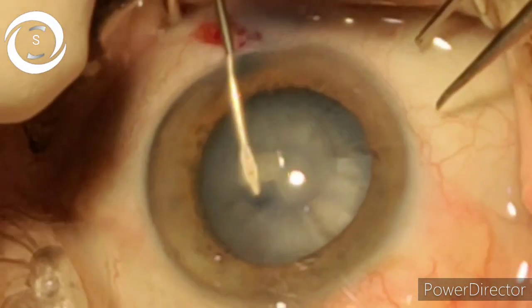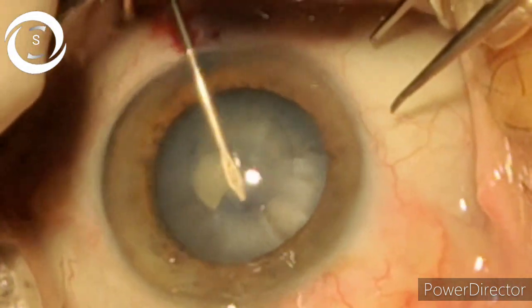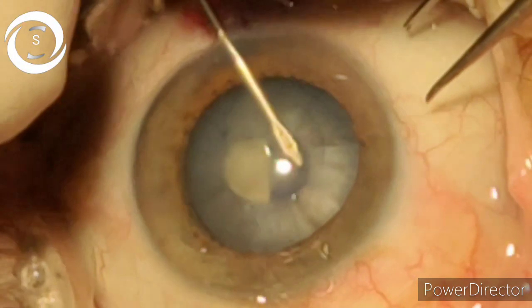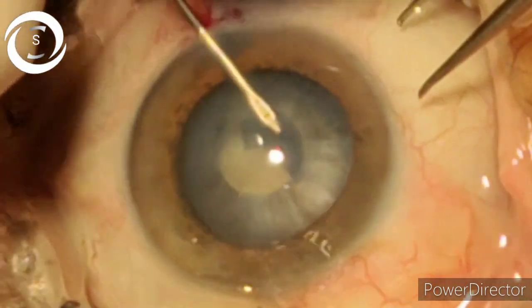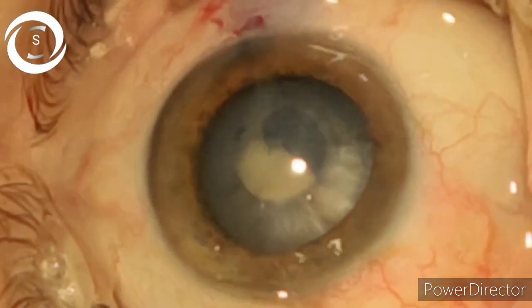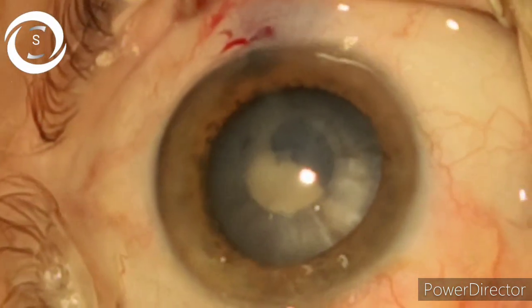First, try to maximally dilate the pupil and put a large amount of viscoelastic to deepen the anterior chamber. Prepare the cystitome as well as the capsulorhexis forceps.